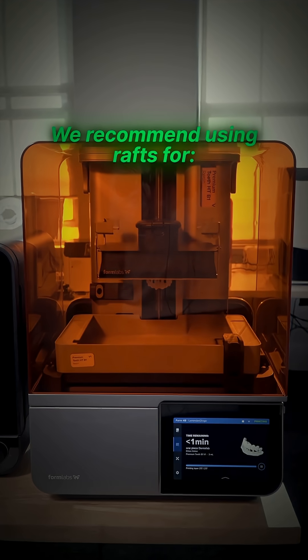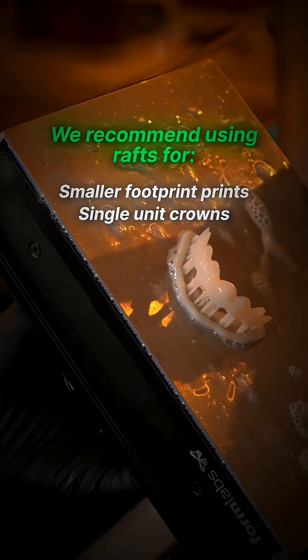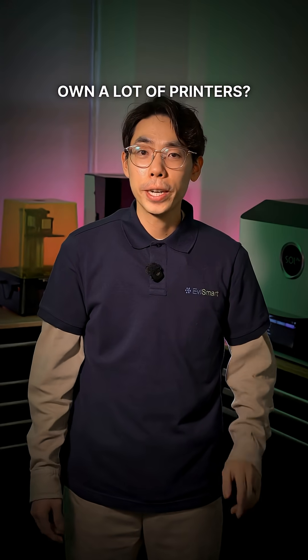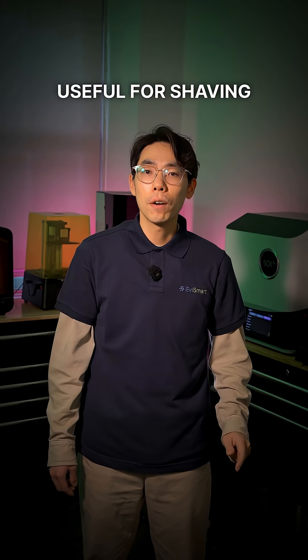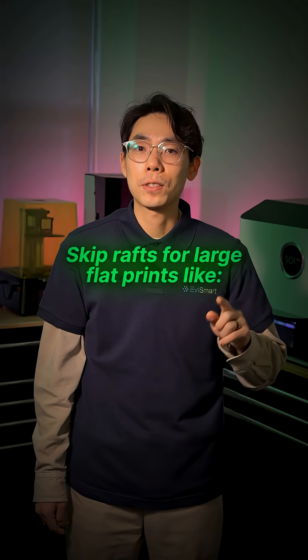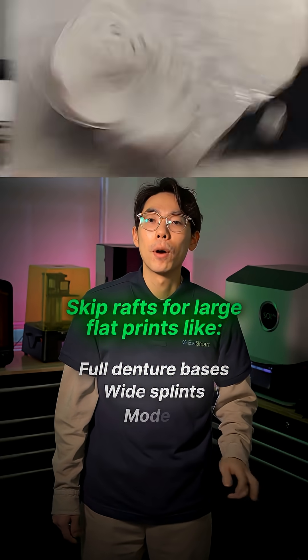We would always recommend using rafts for prints with smaller footprints or tall parts like single unit crowns, surgical guides, and vertically complex designs. On a lot of printers, you can also opt for mini rafts instead of one large piece — useful for shaving off a few minutes of print time and saving resin. You can skip rafts for large, flat prints like full denture bases, bite splints, and models.